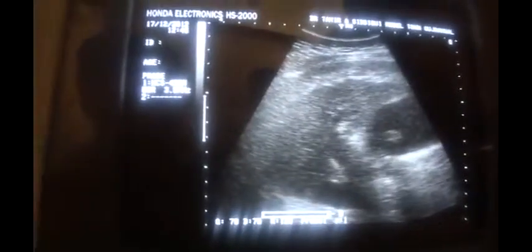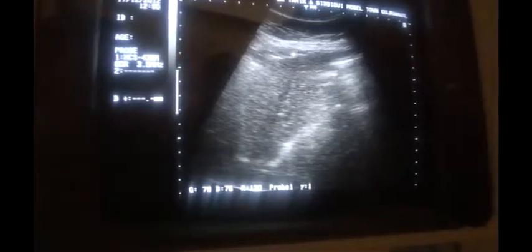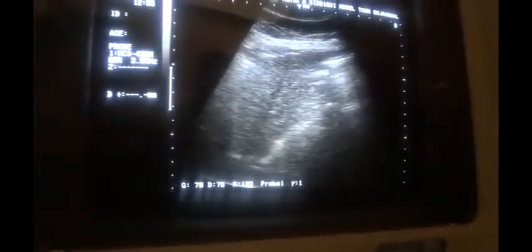This is the right lobe of the liver. This is the gallbladder with the calculus within it. Compare it with the right kidney parenchyma if you want to, but you will see the irregularity of the surface, coarseness, and increased echogenicity of the right lobe of the liver. This is the left lobe of the liver, a longitudinal section showing irregular surface as well as coarseness and blurred margins of the vessels.